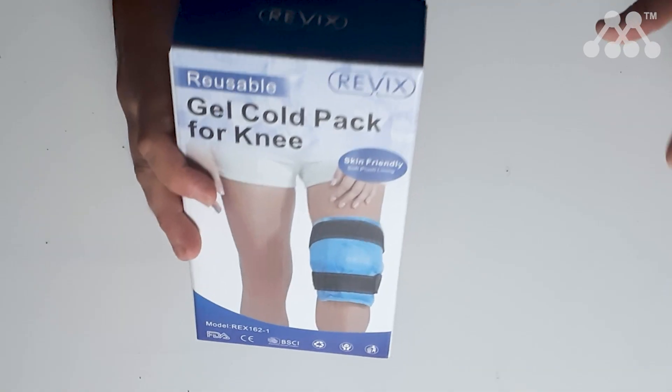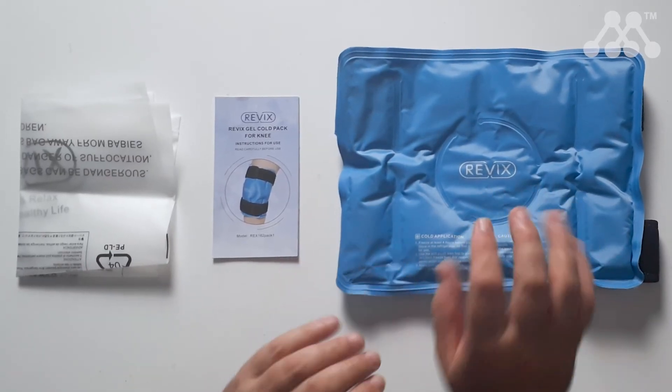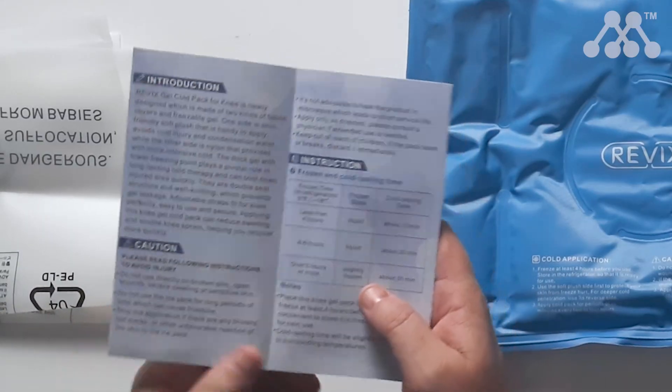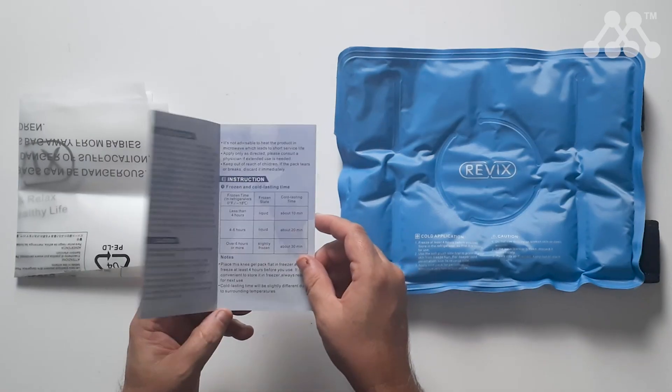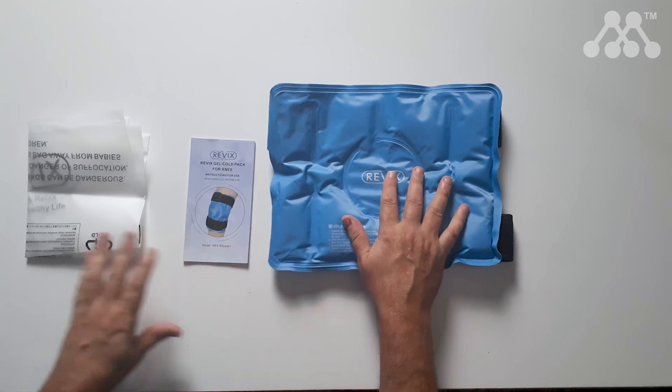The reusable ice pack from Revix is perfect for the knee and other joints. Here's what you get in the box: you get the Revix cold pack itself, and you also get a user manual that explains how you need to use it, how long you would need to apply it, and how long it may last based on how long you put it in the fridge.